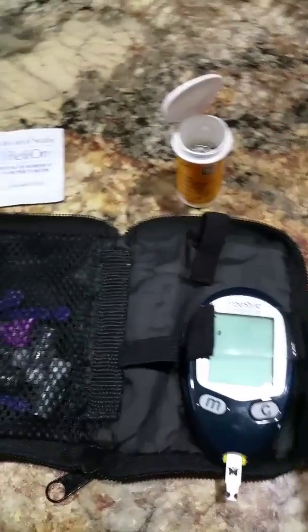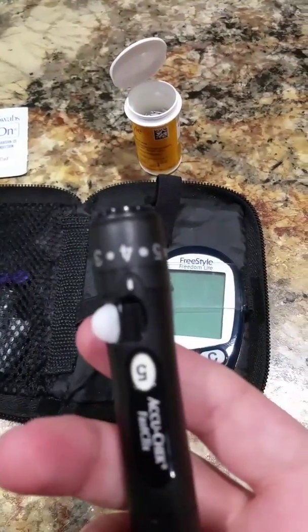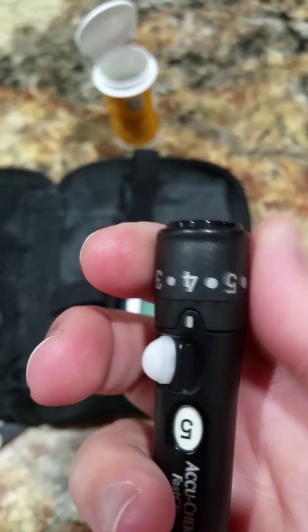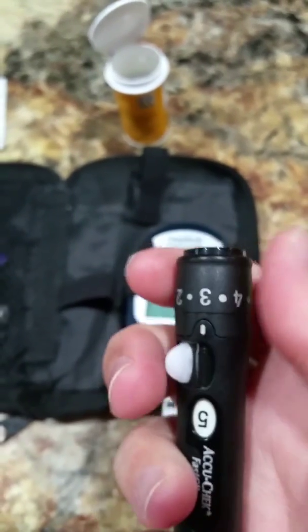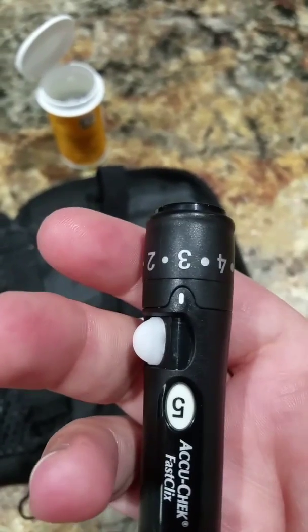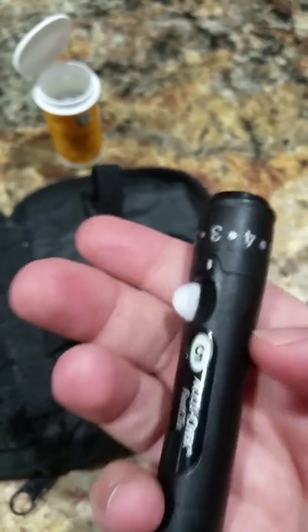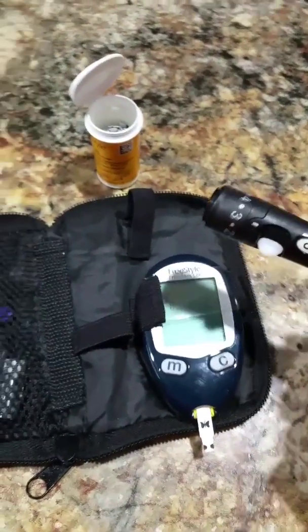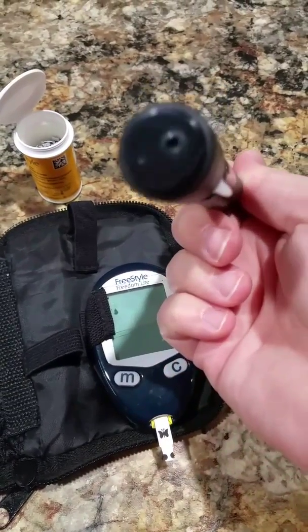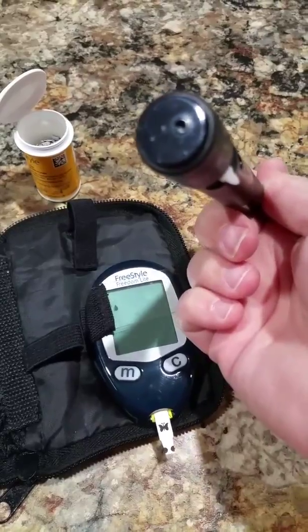So let's see if I can do this. Since this one has the drums inside that keep the needles in there, every time I prick myself, I push this little thing to the side so it gives me a new needle. The top of this tells you how deep the needle will go. So you have really sensitive fingers right now because you haven't been pricking yourself, so you could probably do it on a 3. Mine is usually a 3 or a 4. The trick with these is you don't want to push it into your skin because it will hurt more than it needs to. It has this little hole in it, and that's where the needle comes out.